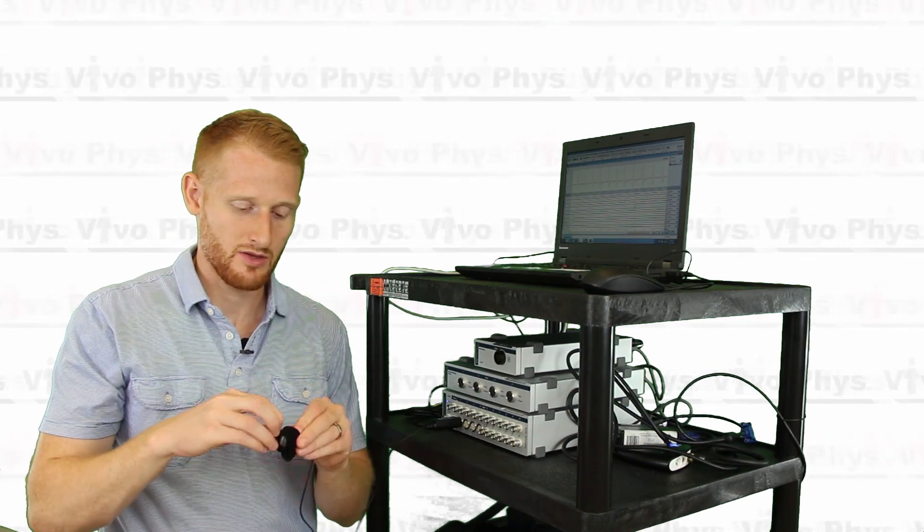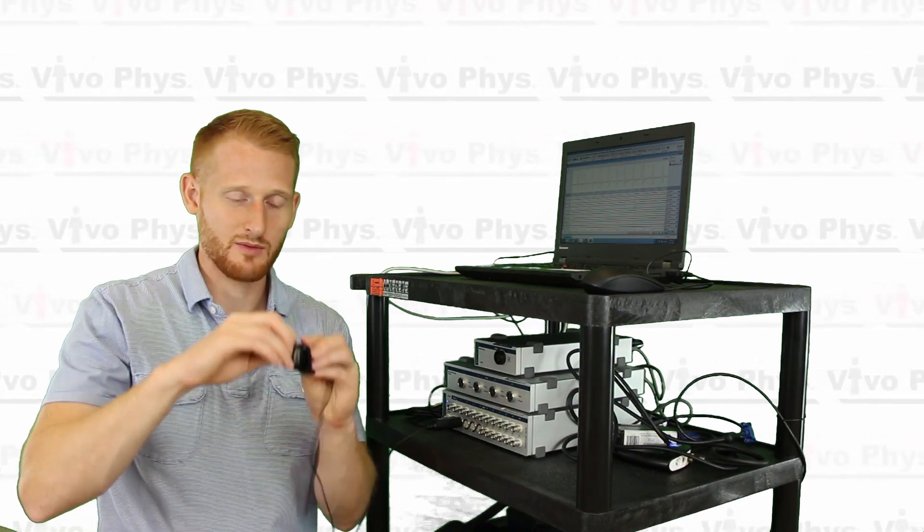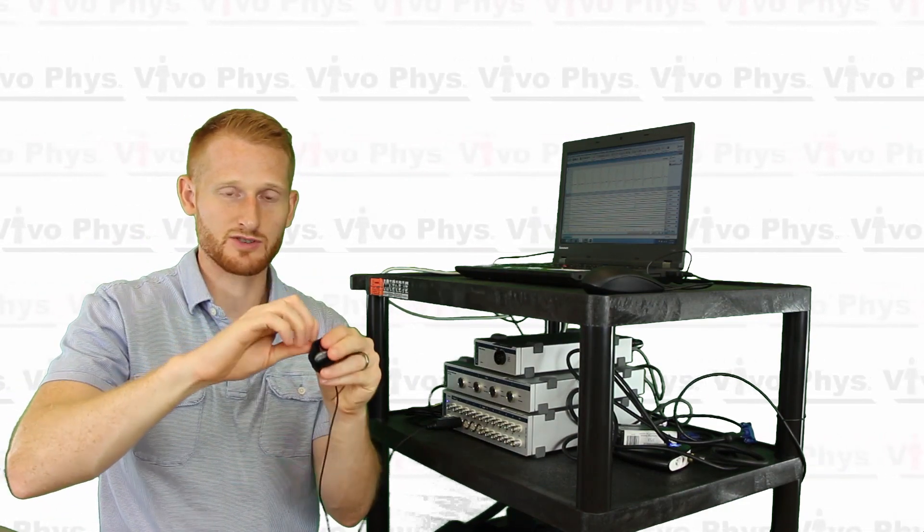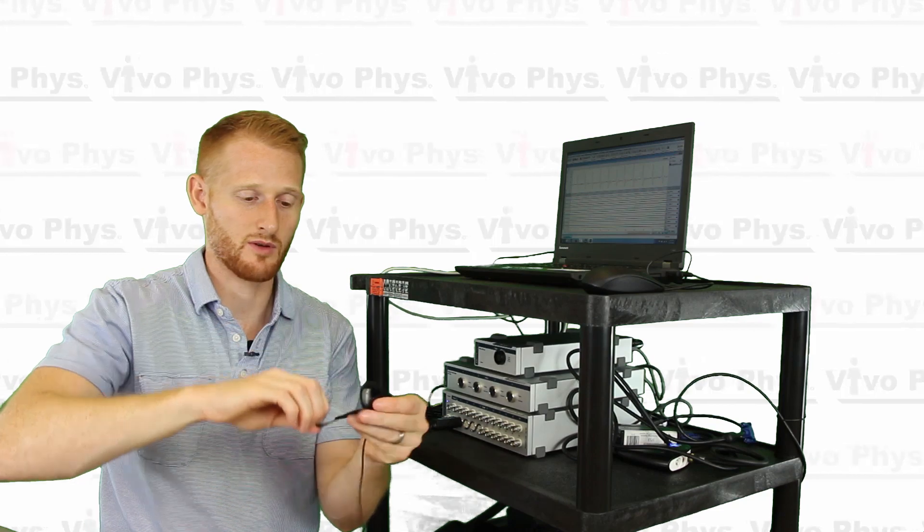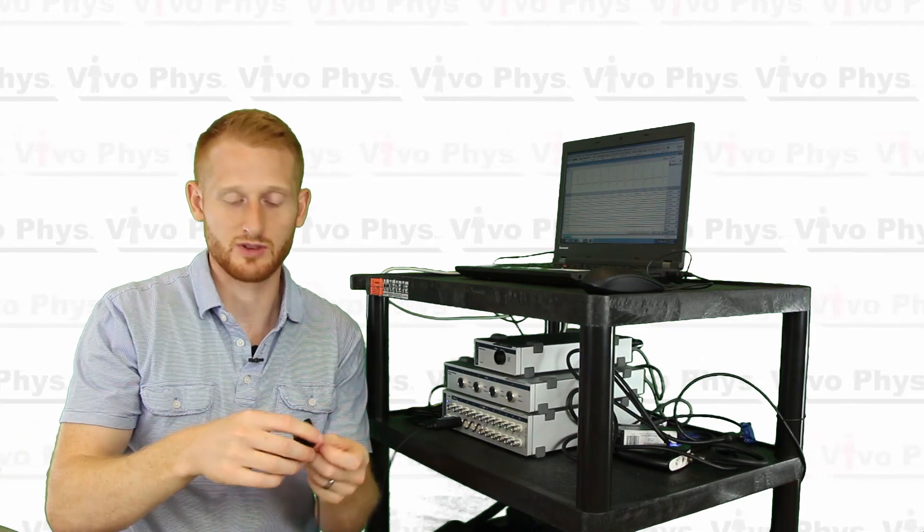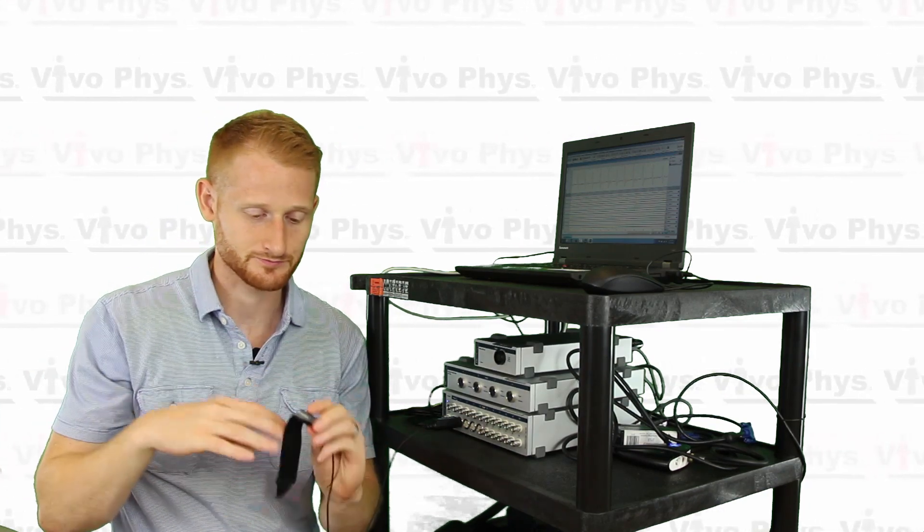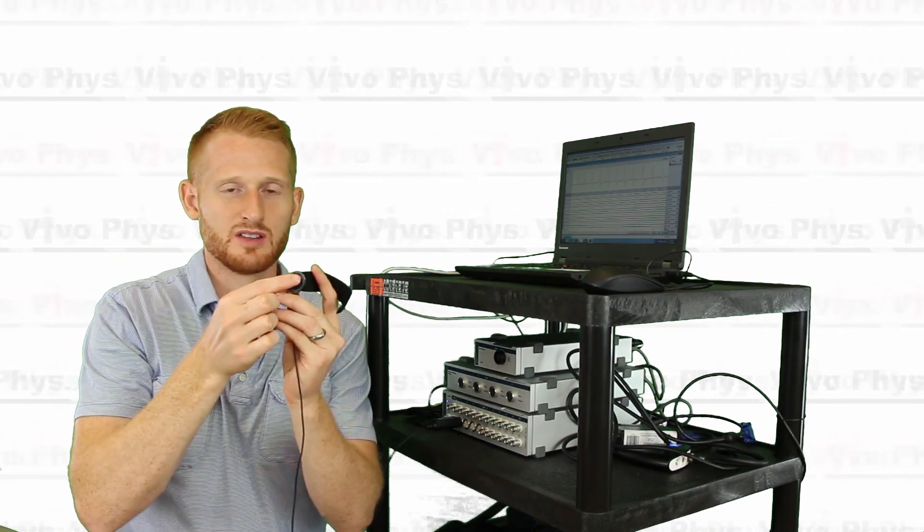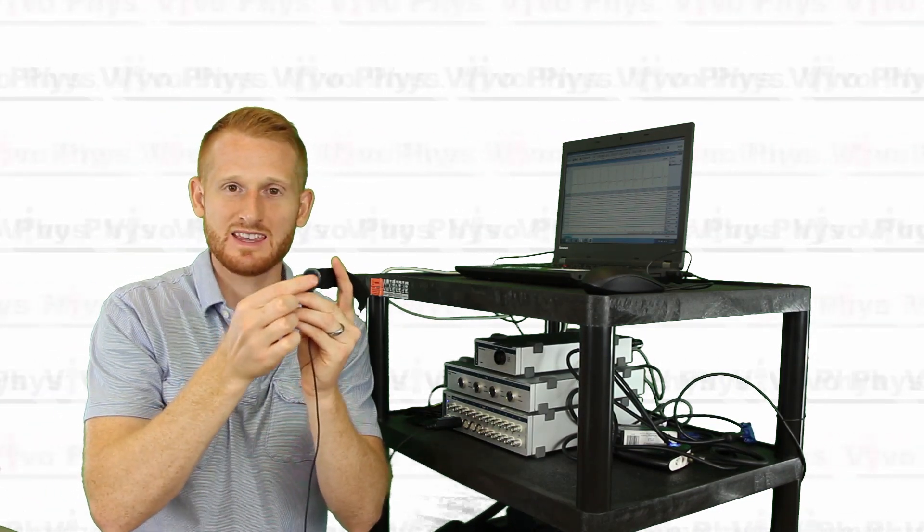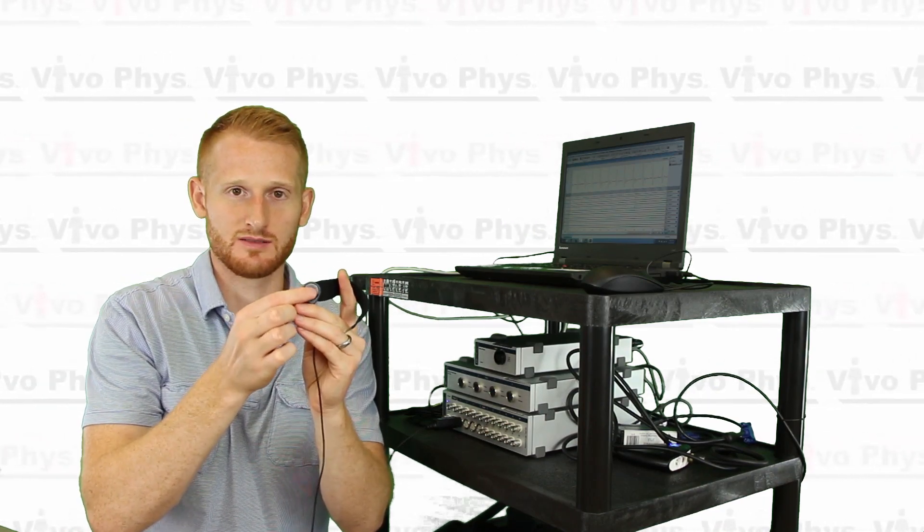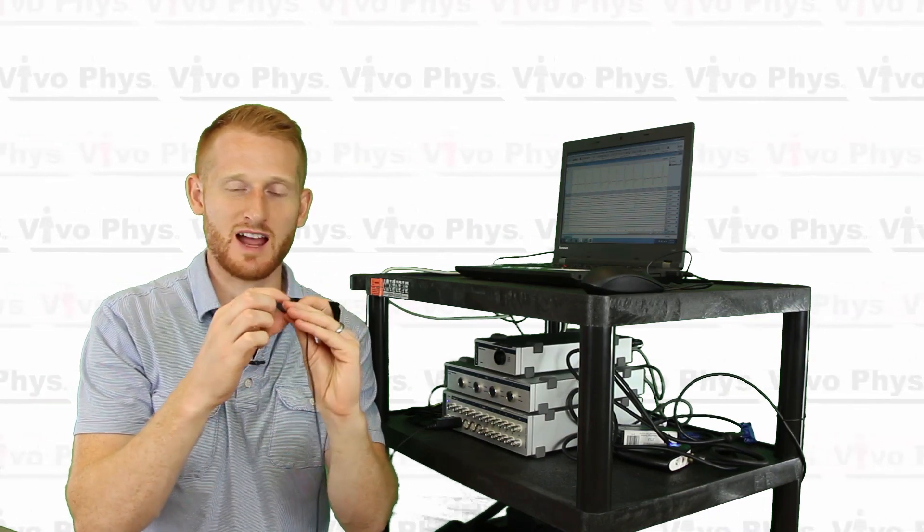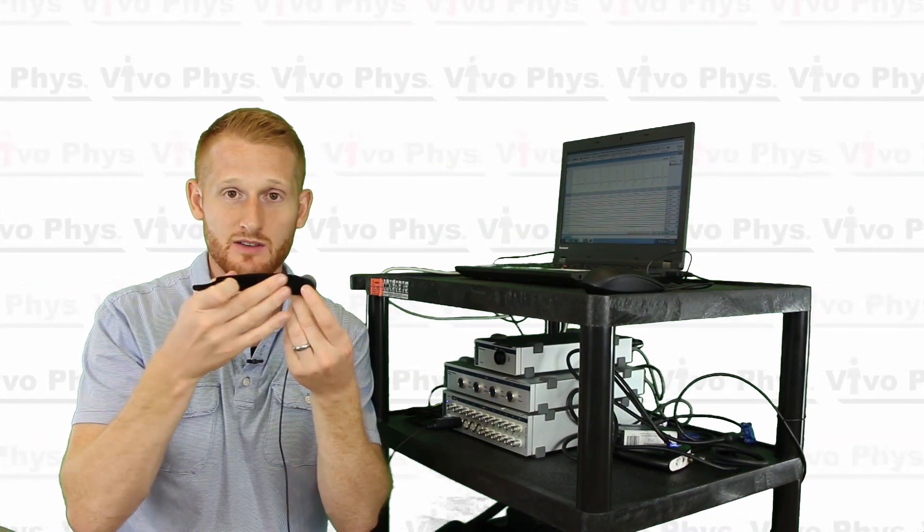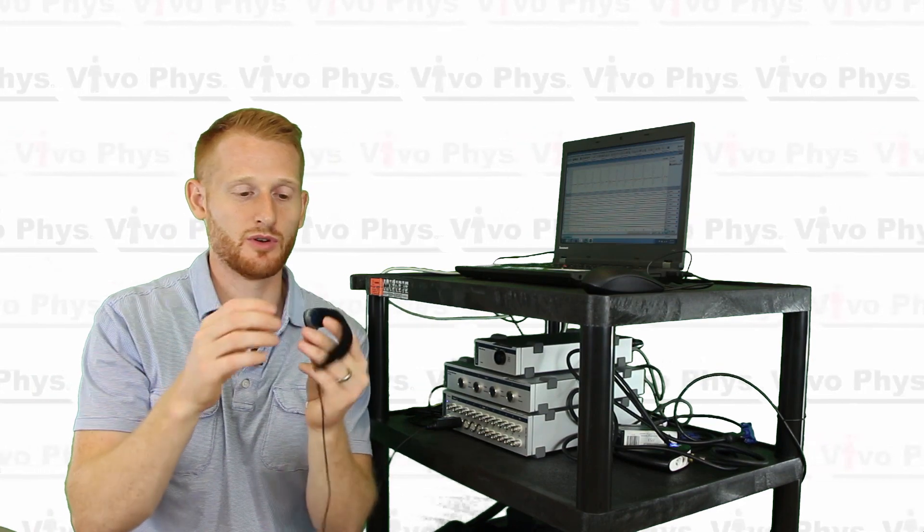Alright, so this little guy, which is the actual finger pressure or pulse pressure transducer, has a little tacky soft side to it and then the other side is covered in velcro.